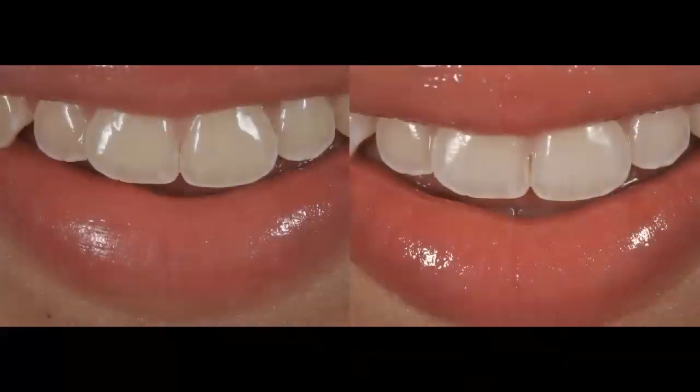And please make sure that you understand this is the reason why you have to train them how to bleach their teeth. And now this photo was taken the day that we started. This is 10 days later. And 10 days later, she was happy. I was happy. We went ahead.